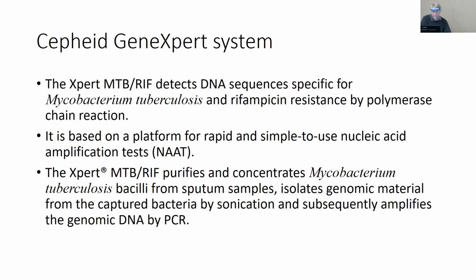Okay. Let's get there. Here is the Cepheid GeneXpert system. The Cepheid is really hot, but the Cepheid's run out of stuff, okay? The Cepheid was a really, really hot technology platform because it's one of the first platforms that did PCR testing for COVID. So NEA Baptist, I know, has a Cepheid and had a student working there last semester, spring, and that's what she did her presentation on for virology. Was the Cepheid, how it works.